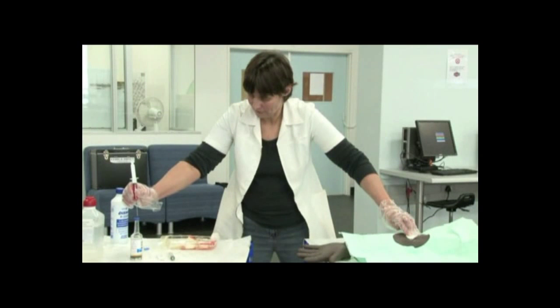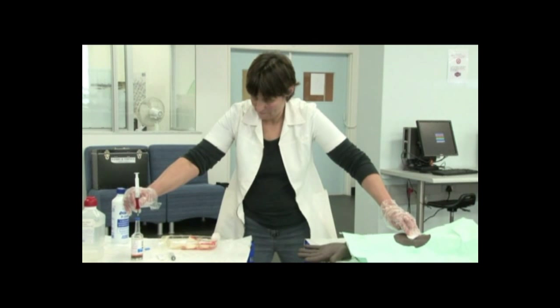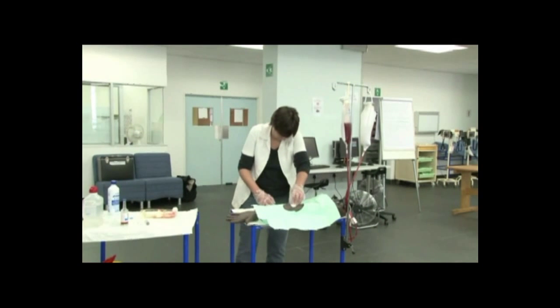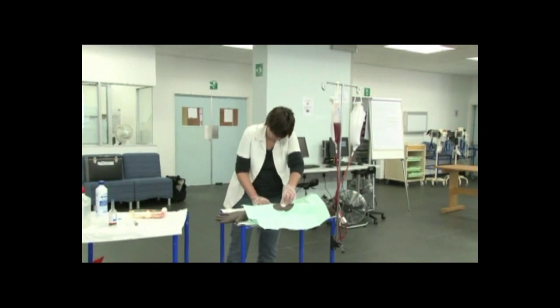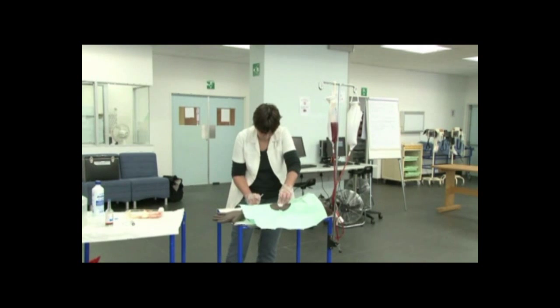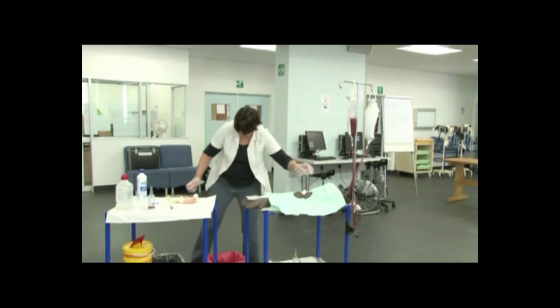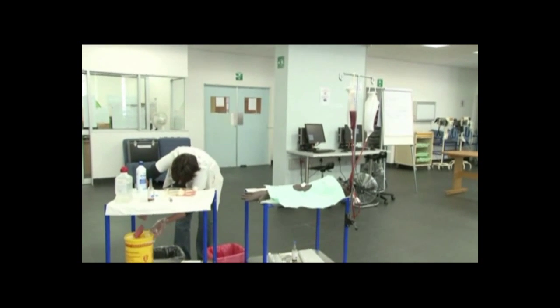Take the blood culture and inoculate the blood immediately into the blood culture bottle. Do not change the needle between sample collection and inoculation. If blood has been drawn for other tests, always inoculate the blood culture bottle first. At this stage, immediately recap the needle using a safe procedure, or take the needle straight to the sharps bin and dispose of it safely.